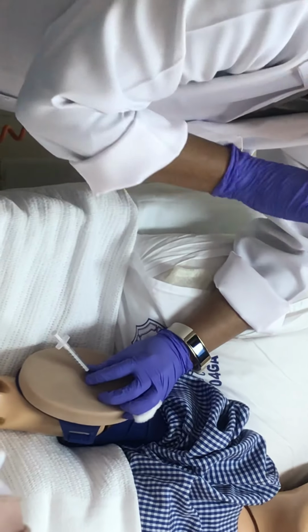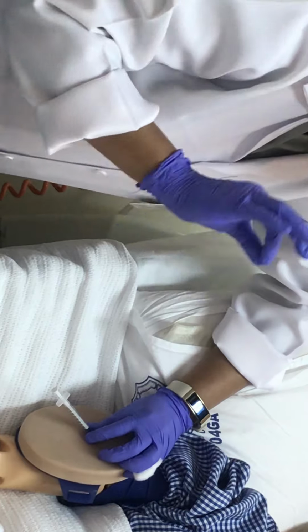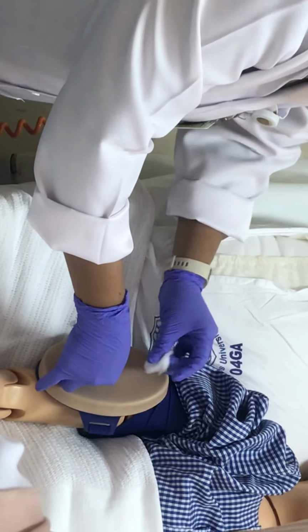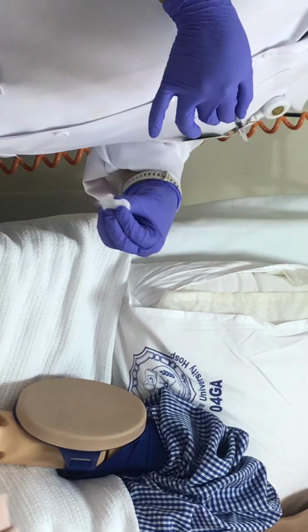Okay, after finishing, wait for 5 seconds. For subcutaneous, only 5 seconds. So let them count: 1, 2, 3, 4, 5. Okay, keep the cotton and remove it. Why are we keeping the cotton? So that the skin is not pulled back. Yeah, that is the reason.